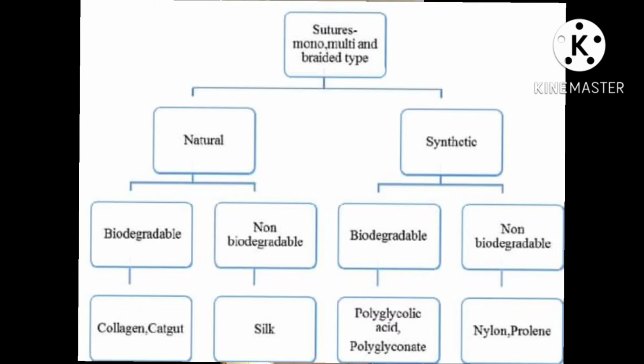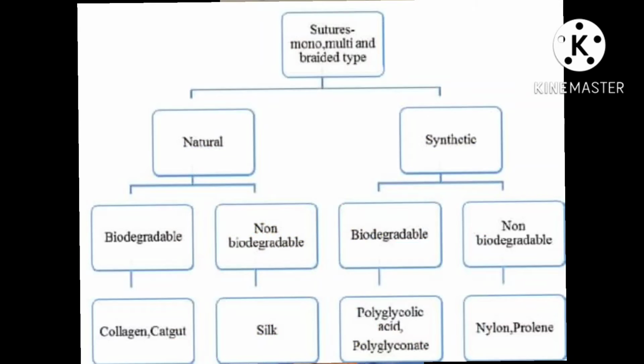According to the needles, the suture in general is composed of the thread itself and the needle. Even the threads we are using for lifting, the same principle with some differences, and of course the technique is different. Needles, sutures come with or without a needle. Sutures without needles are called ties.